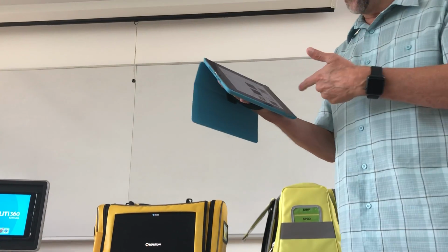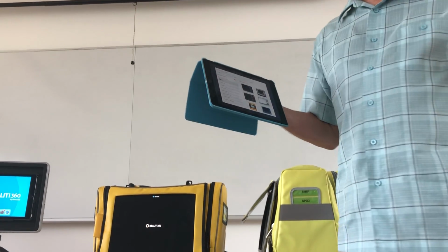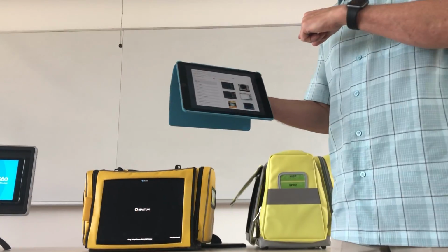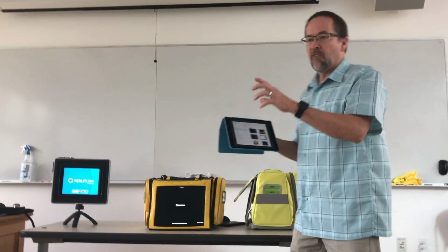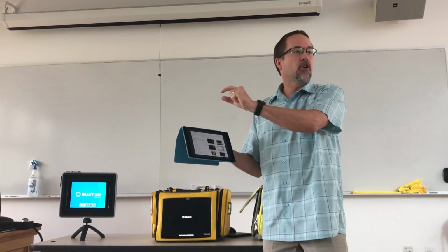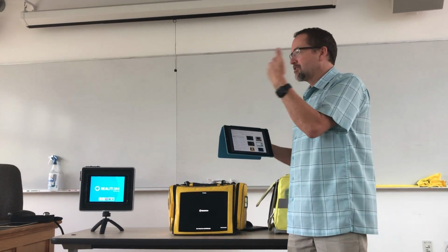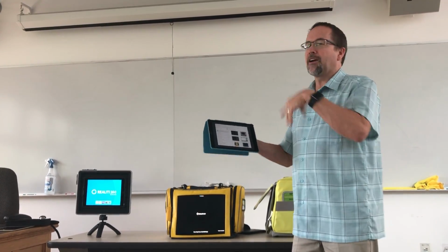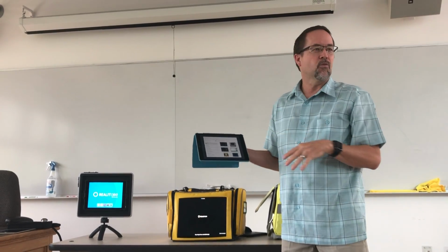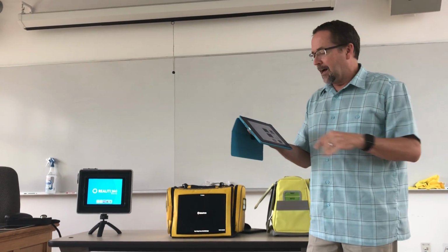What I'm going to do before the start of class on the RCC ones, I haven't done that since we just updated the software, is I go in and I have one that's just a generic RCC startup. So all my instructors know if you go to that one, you'll get normal vital signs, a sinus rhythm, a pulse ox at 96%. You just have a normal, healthy patient. You start from there, and then you can dial in whatever you want to do and where you want to go with it. But at least there's one where it's just kind of a generic startup screen.